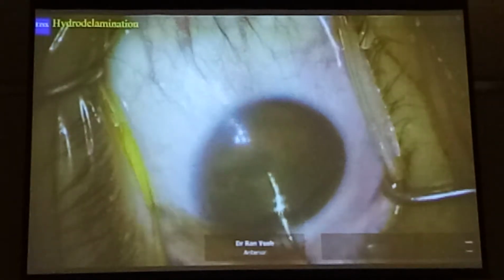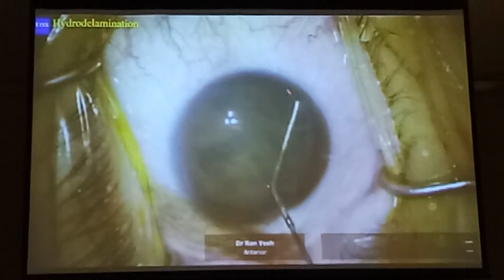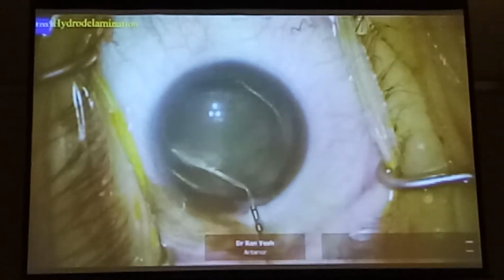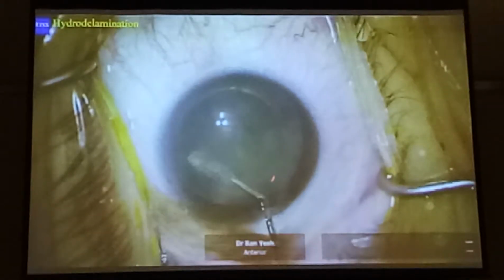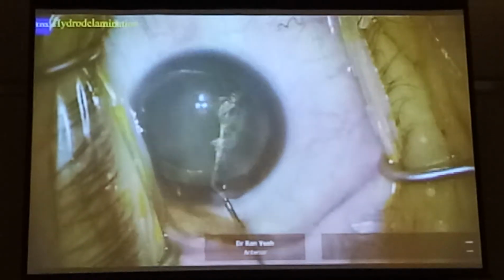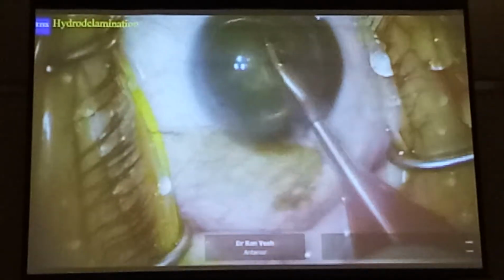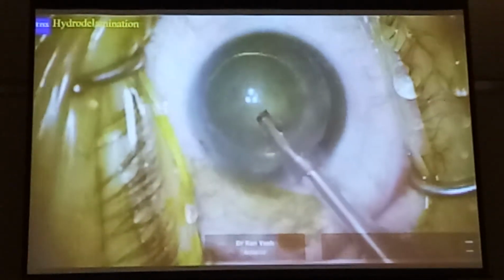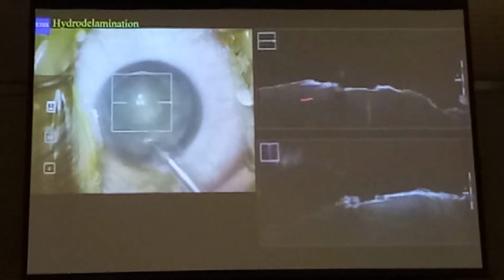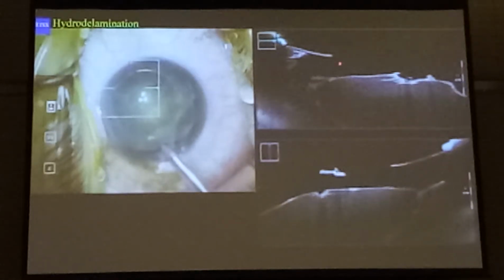Now let me show you the OCT view of hydrodelamination. Okay, so my new toys, I love showing these clips. So we're going to hydrodissect, and I'm going to hydrodelaminate and try and get the golden ring. Now you see that nucleus came out. This is the hydrodelaminated nucleus. So at this point I decide, okay, I wonder what this looks like in 3 dimensions from the side view. Now once I cleared away the cortex, again, this is the front of the nucleus, the disturbed surface from my needle. There's the anterior capsular rexis edge there and there.